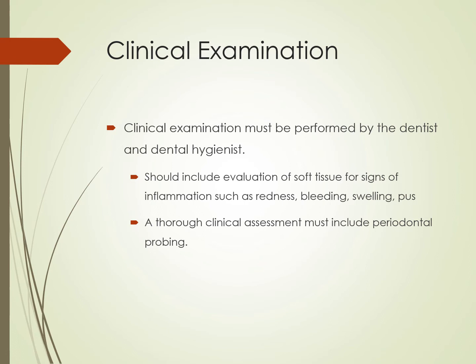So what we do is we do our evaluation, our perio charting. We'll go through, we'll take the radiographs, and we'll present both of these things to the dentist. Now we know, but it is not within our wheelhouse here in the state of Texas to diagnose periodontal disease. And so both of these things are presented to the dentist, and the dentist is the one who gives that final diagnosis. And they are the ones who say yes or no.